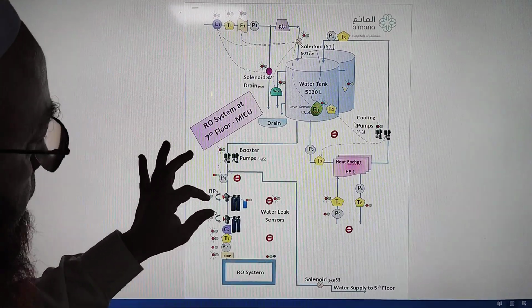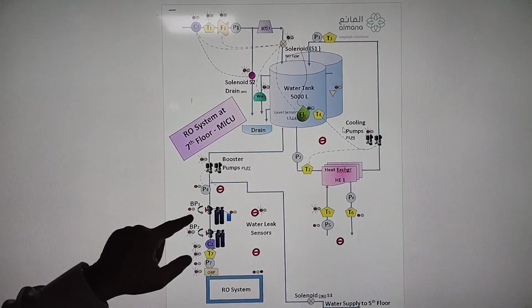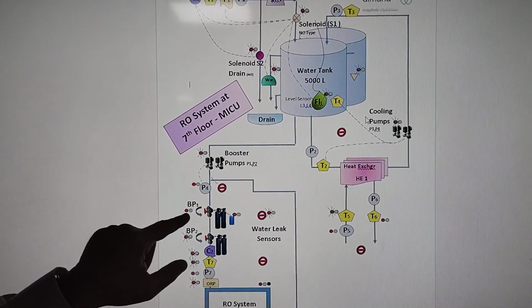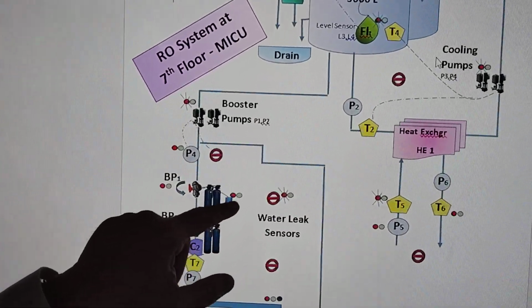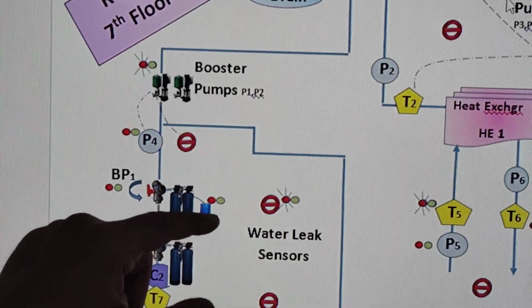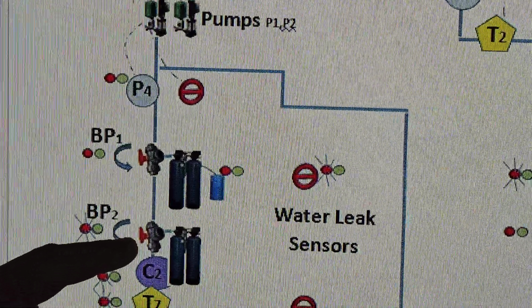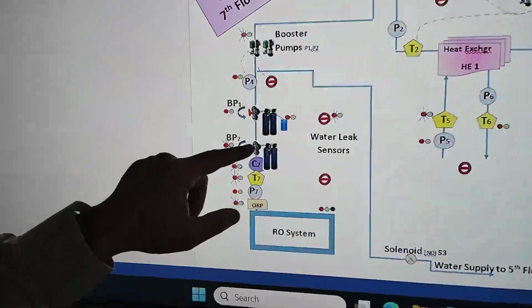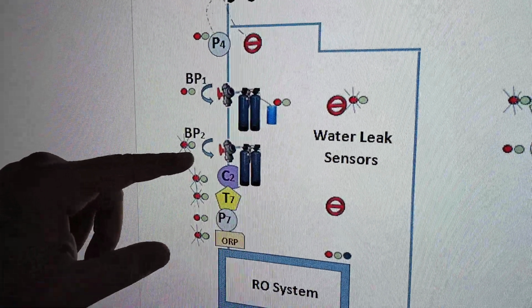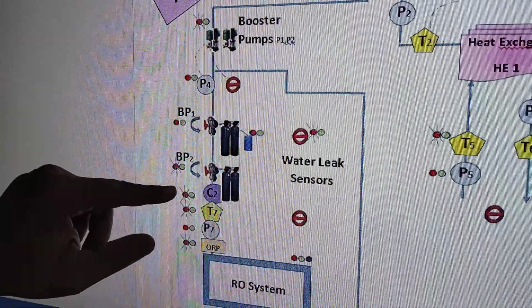Here we have a bypass valve, actually a 3-way valve. If you bypass, then there should be an alarm over here and an indicator as well. We have a brine tank; if the level of the brine tank goes down, it has to give an indication. Then comes a carbon filter. Even for the carbon filter, we have a 3-way valve, and there should be a bypass. Whenever it goes into the bypass, it should give us an alarm indication over here.